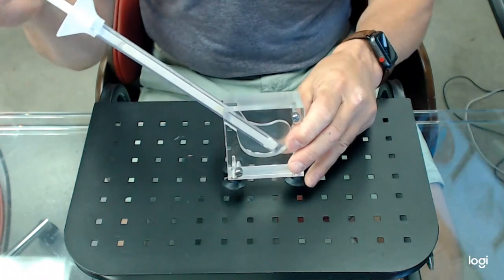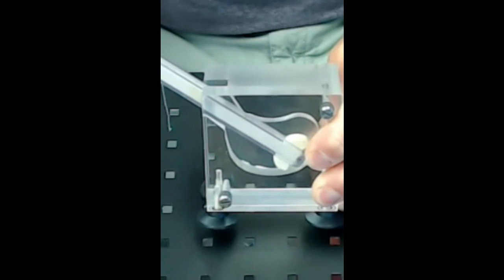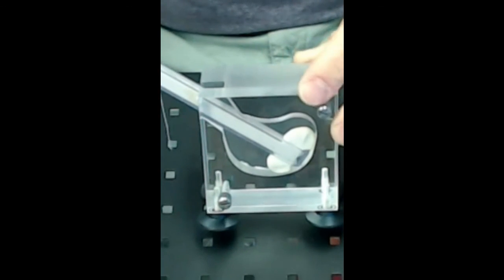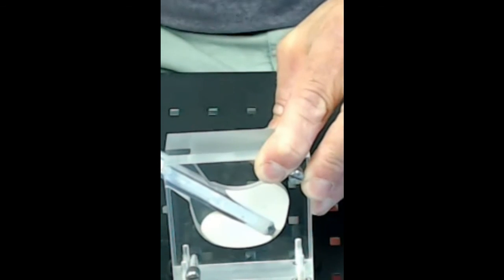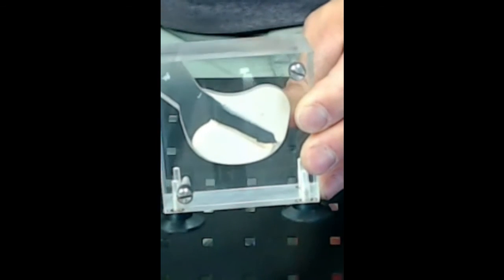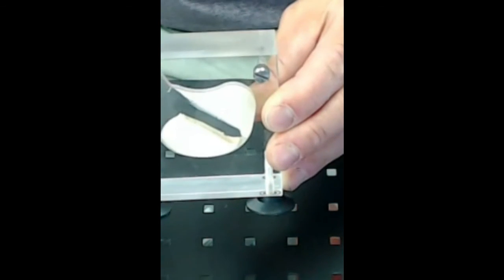And then what's done here is they'll go in and advance this. This is a demo, so you'll see how it fills the inner space. After they're done, they'll pull this out and remove this. And the interbody will typically get placed. We'll go right in and fill that space right here. The interbody will go in, and they'll either leave it there or turn it transverse, and then they do the rest of their fusion.